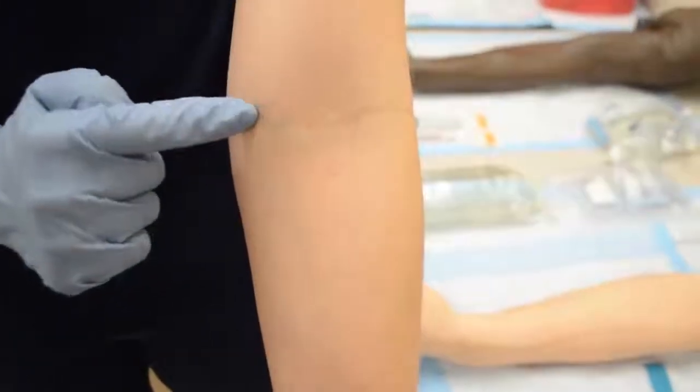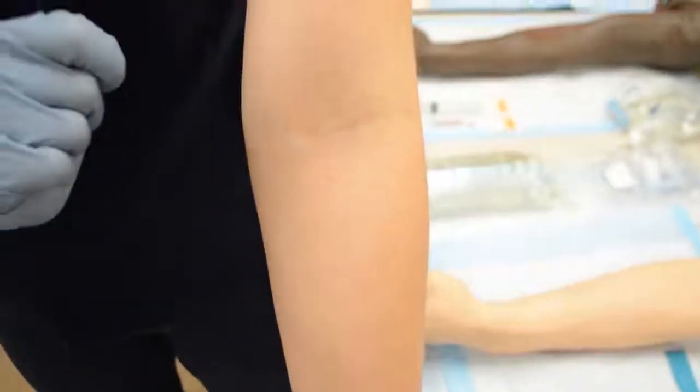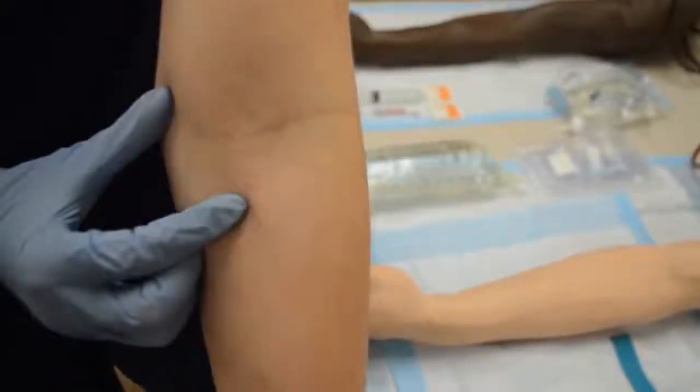And some veins also are not straight, just like this one is or this one is. Sometimes they're set in squiggles. So what we want to do is start at the bottom and hold taut, applying as much pressure as we can to straighten out the vein the best that we can.